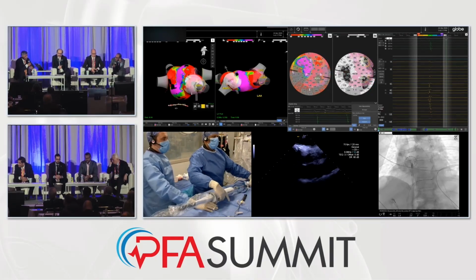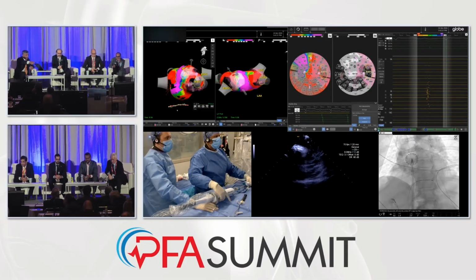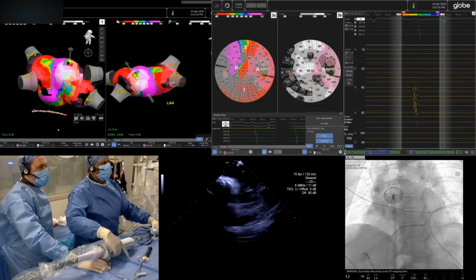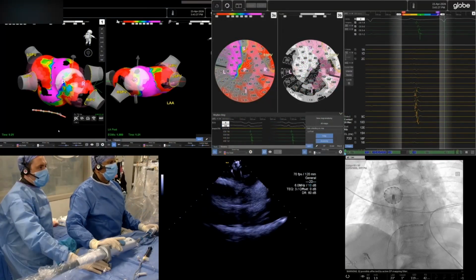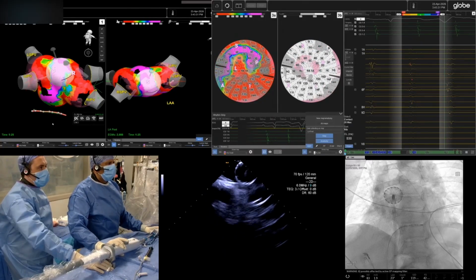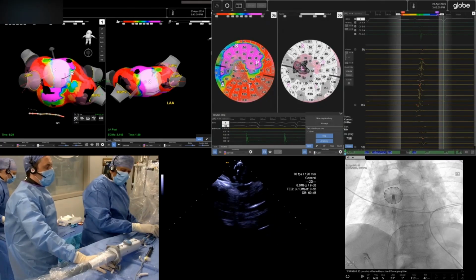I mean, oftentimes, when you want to do a posterior, actually, he's going to do a little voltage map now, so you can sort of see what it looks like. You get pretty proximal isolation because yes, you're pushed up against tissue, but the tissue doesn't stretch away, right? It's still enveloped around the array. Can you go straight PA, please?